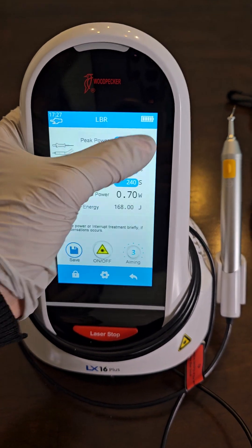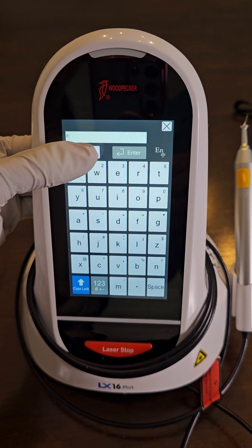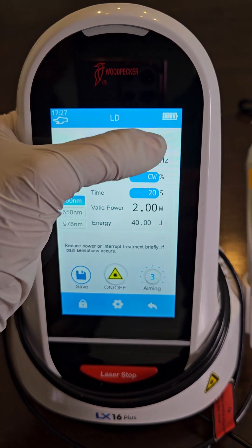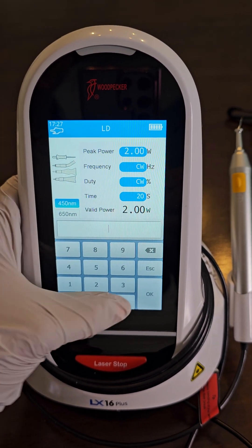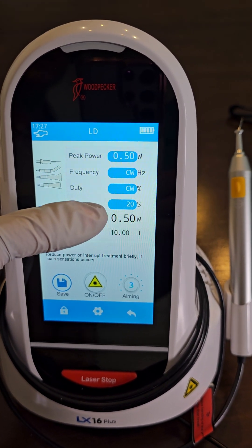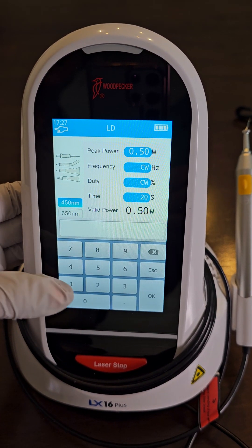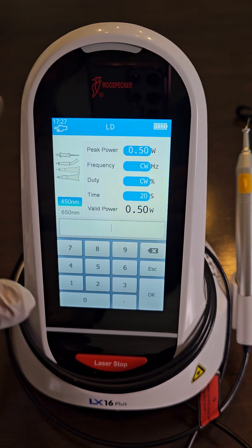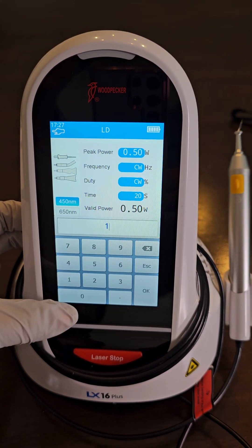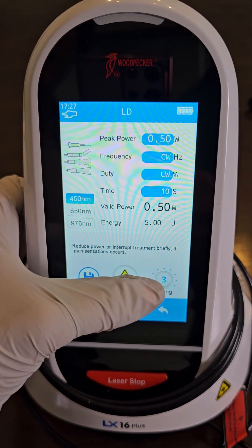Now let's program LD. Caps lock on — L, D. Save that. Power is 0.5 and we want continuous wave. For time, this is completely up to you. If you don't want to treat anything more than 10 seconds you could set it to 10; if you don't want to worry about the time maybe you set it to 300. Time is honestly personal preference.